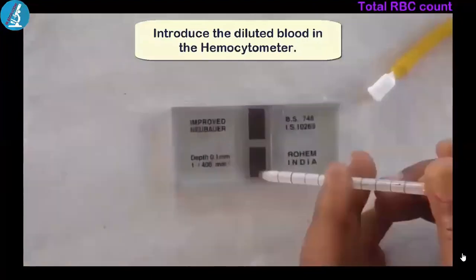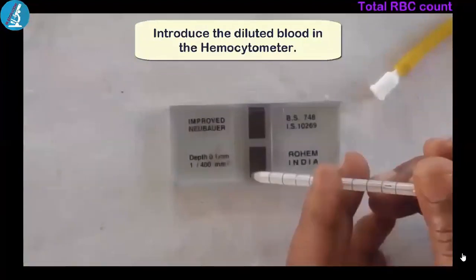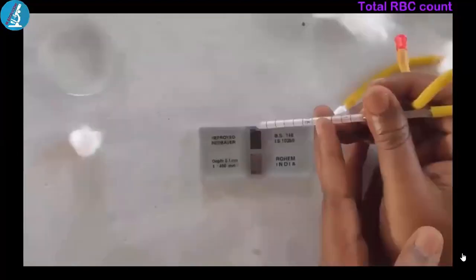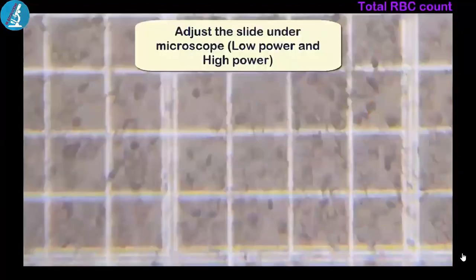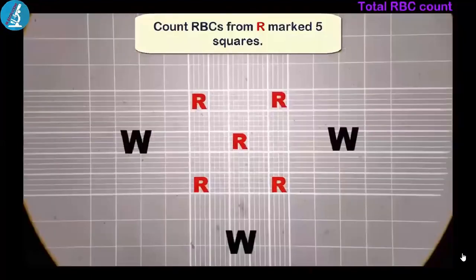So you introduce the diluted fluid in the hemocytometer gently so that you avoid creating bubbles, because once you have bubbles there, they will interfere with your readings or your results. So you load on one side, and then you also load on the other side. Then you replicate the results, because you count this side and the other side, so you'll be able to tell. So you adjust the slide. You adjust your microscope so that you view where you're going to do your counting.